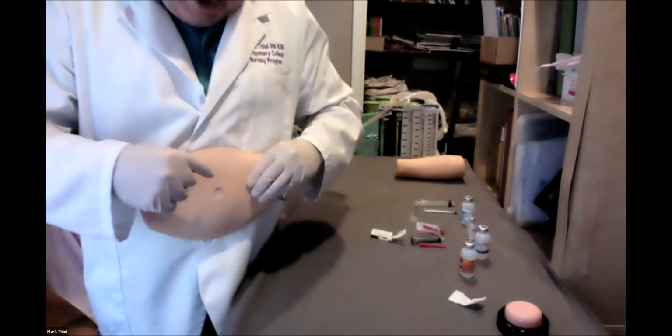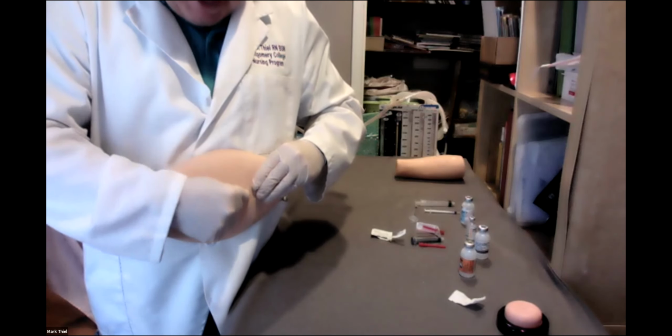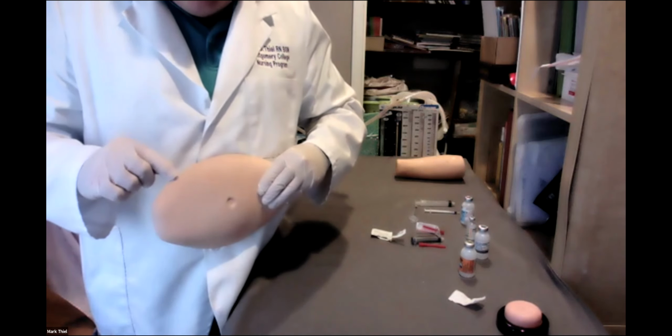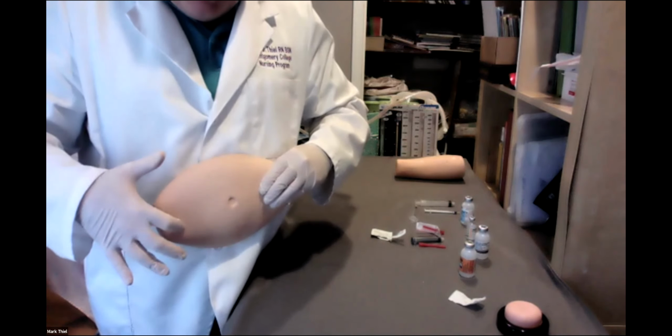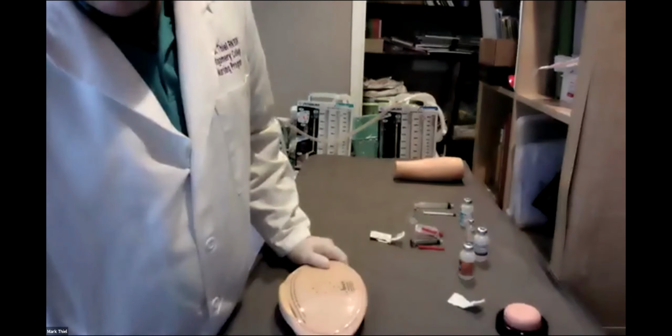Of nursing note, we never inject, obviously, into the umbilicus, and we stay outside 2 inches from the umbilicus. So your injections are out here. Of other sites, the fronts of the thighs into the sub-Q.